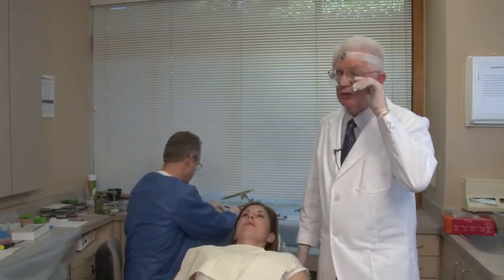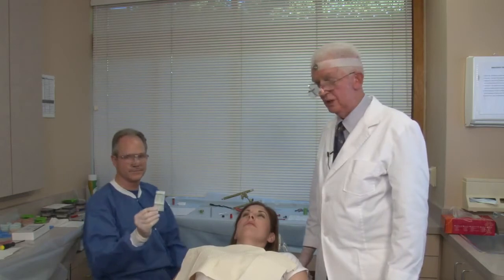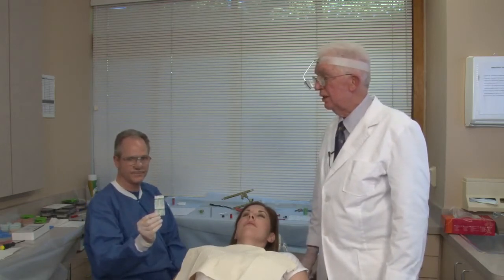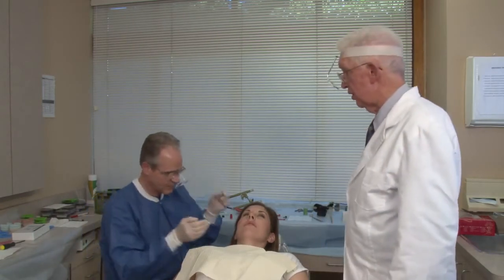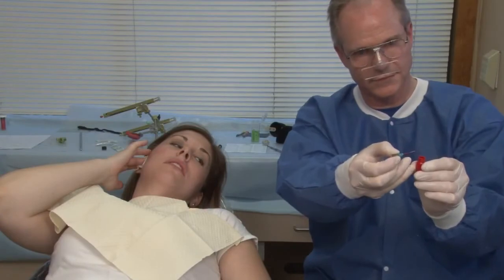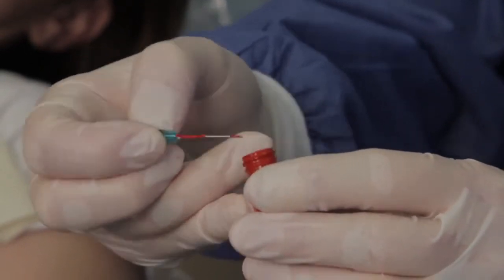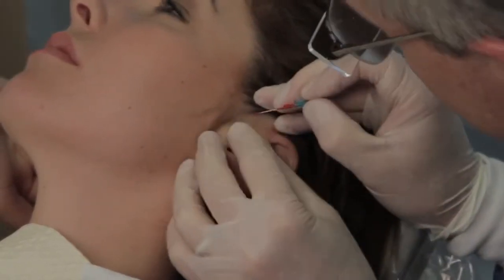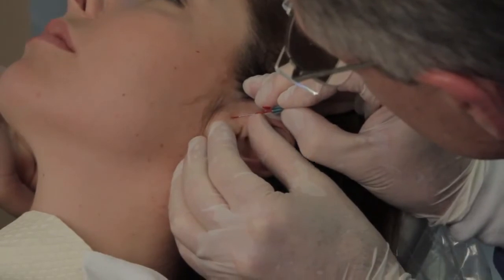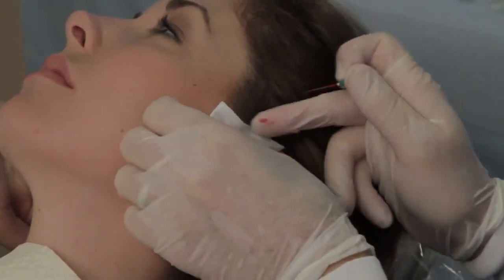Dr. Mills is going to do the tattoo since this is on his patient, and he's using a 23 gauge lumen needle and the tattoo dye. And before we put the marks on the patient's cheek, you remember I used an alcohol sponge and I cleansed the tissue good with the alcohol sponge. When you use the needle to do the tattoo, make sure you get enough ink on the needle. But what you want to look at also is the lumen of the needle, to see if there's dye inside the lumen, because you can have a lot of dye on the outside of the needle, but when you prick the skin it wipes that part off. So it's the amount of dye that's in the lumen that's extremely important.